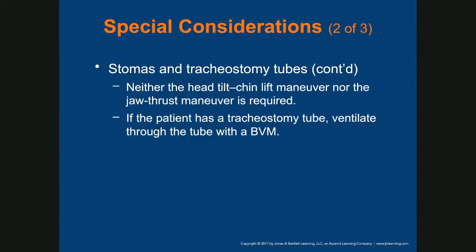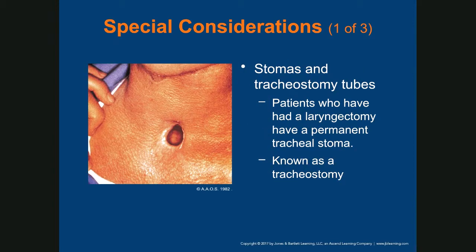Now, if you're going to suction the stoma or tracheostomy, it must be a sterile technique. So you have to have on sterile gloves. Once you have on these sterile gloves, your hands cannot pass your waist, right? And you will use a flexible catheter, and the catheter does not come out of the pocket until you're ready to use it. So it comes out of the pocket and goes into the opening, right? That's how we will suction. You don't want to exceed more than 10 seconds with that.